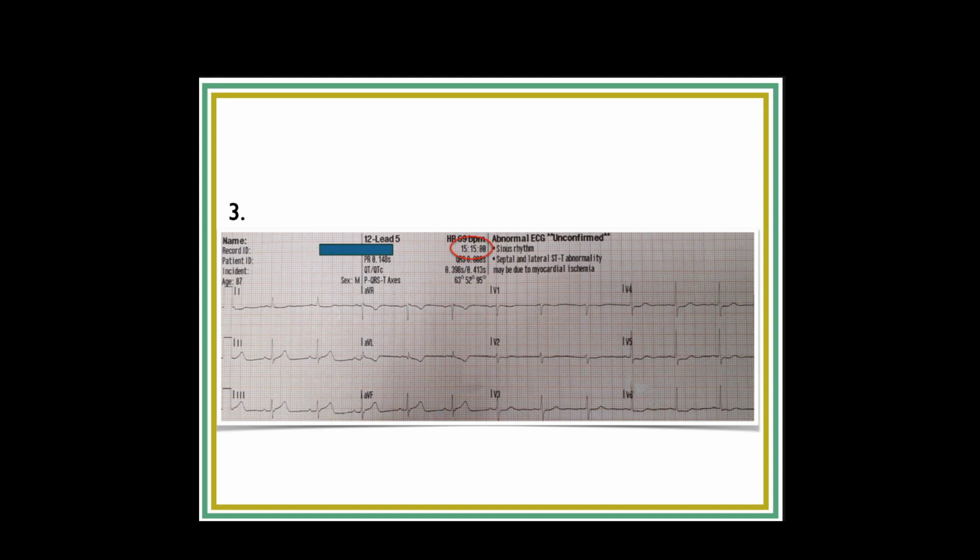Okay, but now you can see the change. Look how much AVL has changed, right? And now we're starting to see some changes in the inferior leads as well. So let's go back for a minute. That's about a minute and a half change. So that's a big change in a minute and a half.